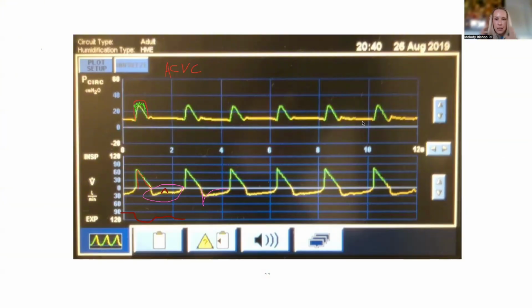So just to get a sense of what they're doing, specifically what their inspiratory flow demand is, I would probably consider throwing them into pressure control. And then from there, looking at those flow rates that they are asking for, because remembering in pressure control, flow is mostly variable, and patients can pull whatever they want. From there, you'll probably see their inspiratory flow rate skyrocket, as they are pulling all the flow that they want to achieve the pressure that is set in pressure control.